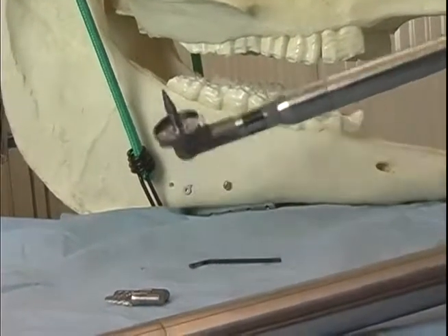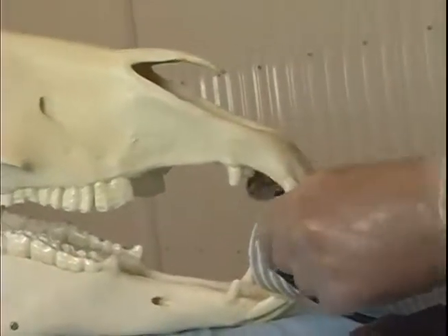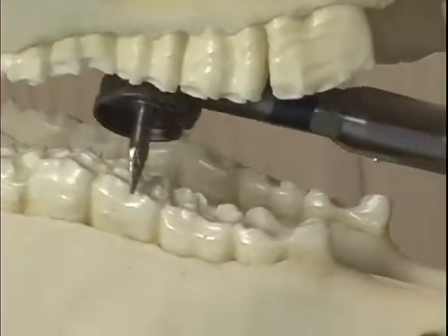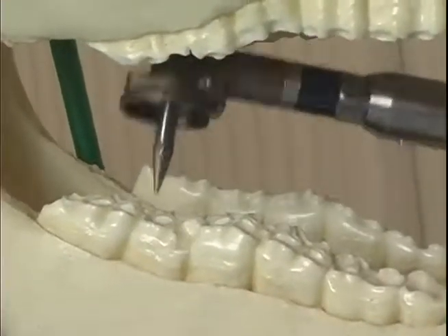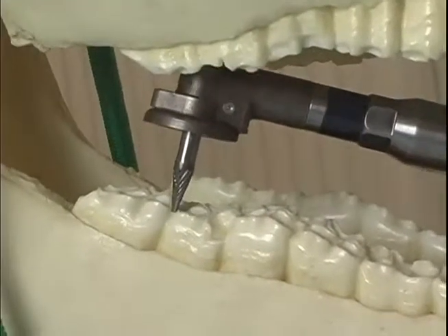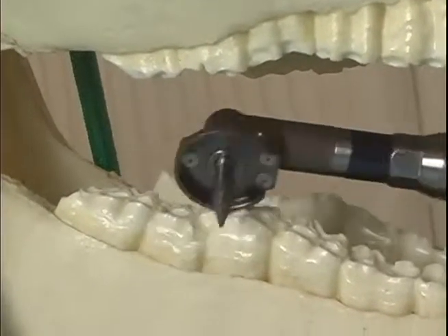This is a tall diastema burr. We have shorter ones as well, but it is introduced into the mouth, and burring will take place somewhere. Let's say we have a diastema back here. We would simply get this positioned and we would burr a path between the teeth to open it up so that the food material can pass back out.